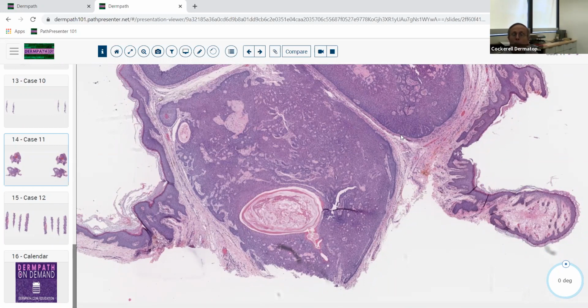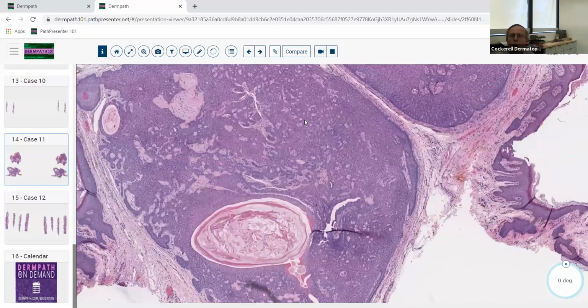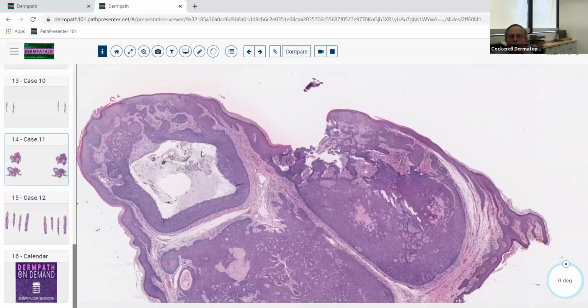And when it occurs in a sun-protected area, often the scalp or the groin, often in a dark-skinned patient, they tend to behave as a low-grade basal cell carcinoma. They get larger with time, they gradually ulcerate. You want to excise them. They tend to recur if you don't get rid of them all. So we'll often call these basal cell carcinoma with trichoblastic features if they have this morphology. So it's kind of in the spectrum of a trichoblastoma, which is an adnexal neoplasm with areas of actual basal cell carcinoma that's developed within those areas.